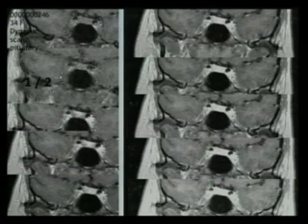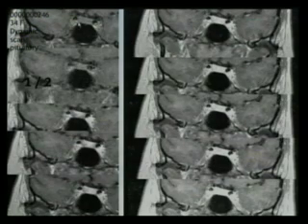This is a dynamic scan. So the first image here, this is a coronal, by the way. The first image is taken without contrast, and then eventually contrast gets pumped in. And you see here, there is a little area that doesn't enhance initially. Eventually it fills in. Here it fills in completely.